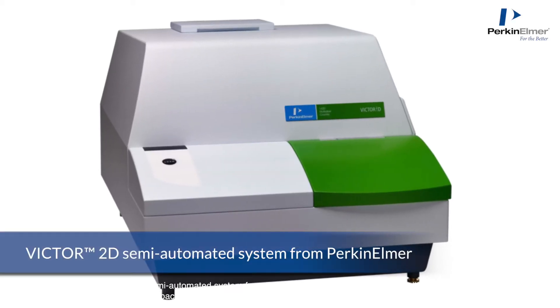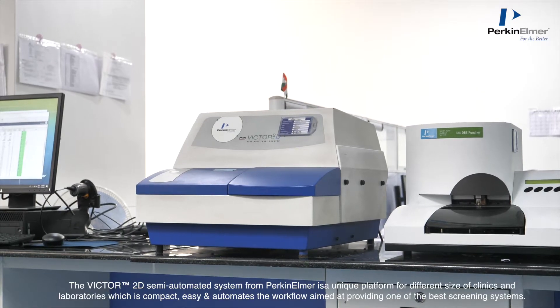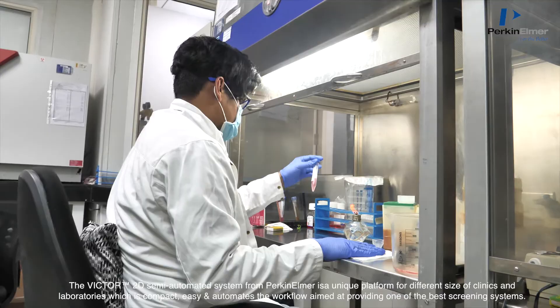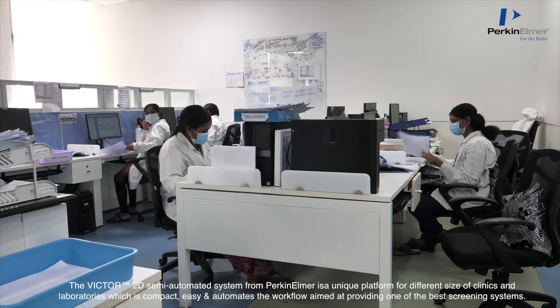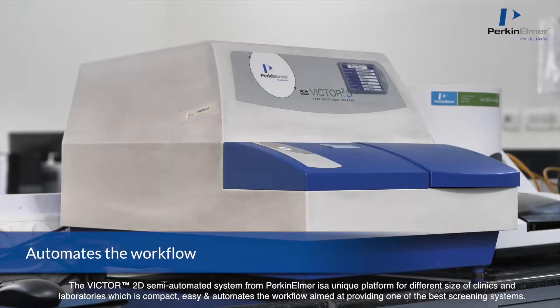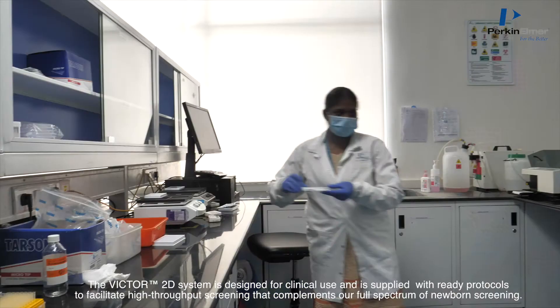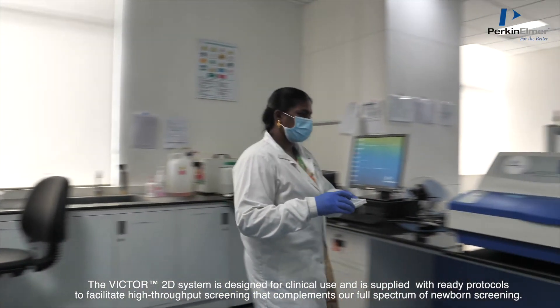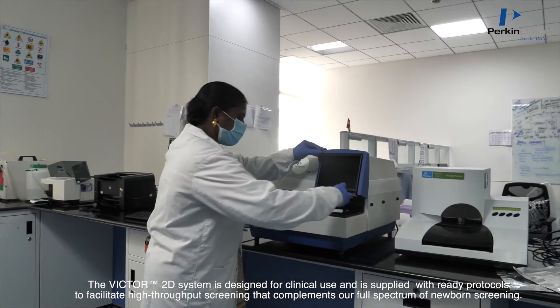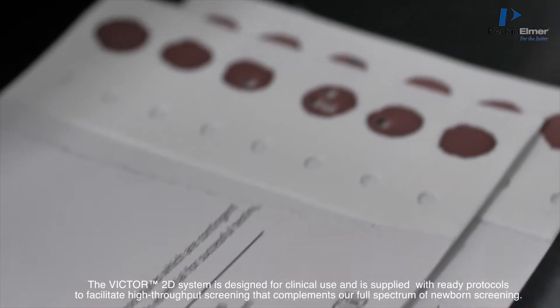The Victor 2D Semi-Automated System from PerkinElmer is a unique platform for different sizes of clinics and laboratories, which is compact, easy, and automates the workflow aimed at providing one of the best screening systems. The Victor 2D system is designed for clinical use and is supplied with ready protocols to facilitate high throughput screening that complements our full spectrum of newborn screening.